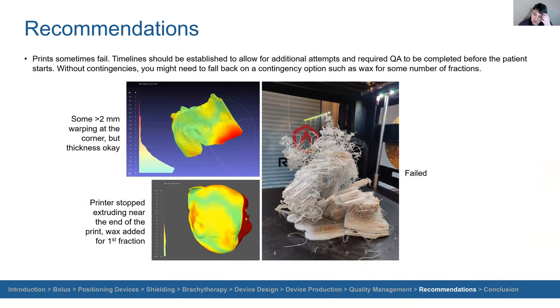As mentioned before, prints sometimes fail. I would say clinically, you should have timelines established to allow other attempts to be made if QA does fail before the patient starts. And without those contingencies, you might need to fall back on conventional techniques like wax.